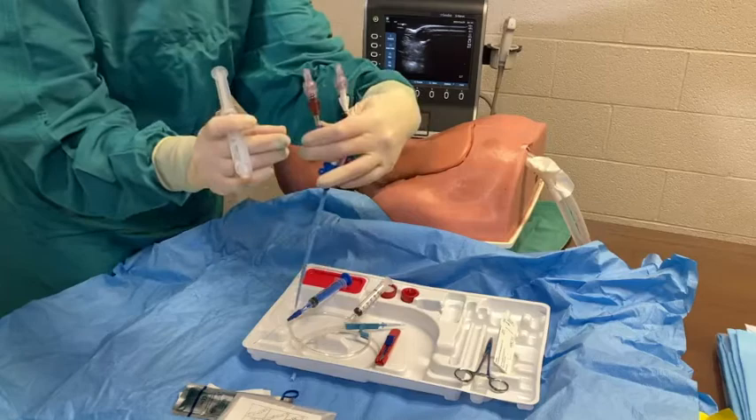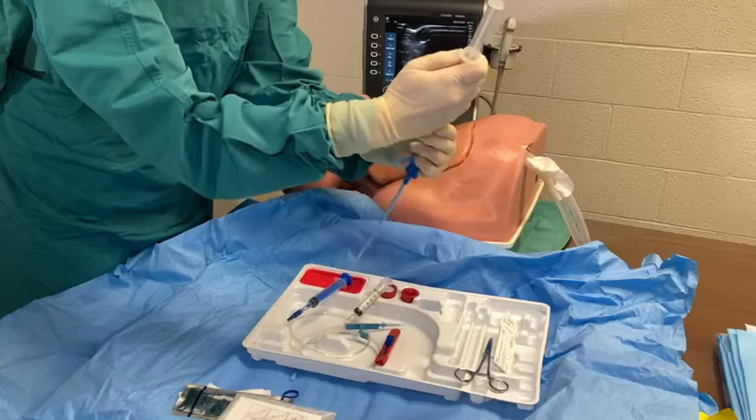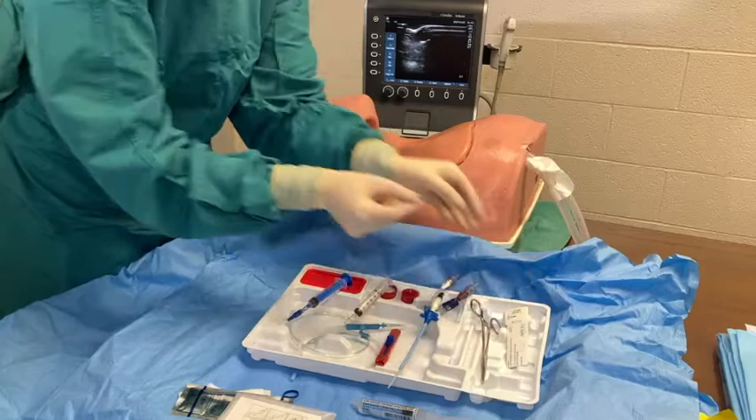Flush each port before use. The forcep and suture in the kit will be used to attach the MAC to the patient's skin.